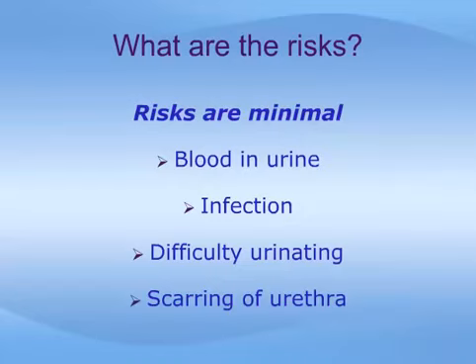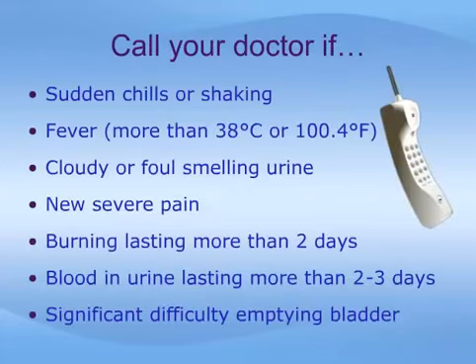Any time that instruments are passed through the urinary tract, there is a small risk of later developing some scar tissue there, which can lead to symptoms of a blocked urinary stream. The risk of this with modern instruments is very small.